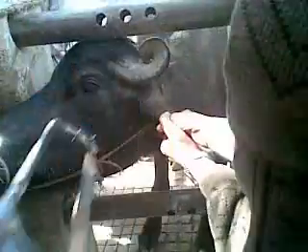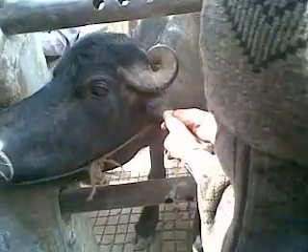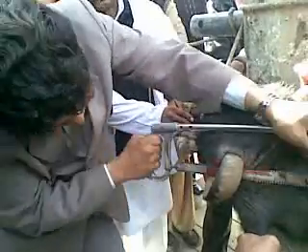I am in the soft tissue, therefore the animal is irritated. Now I am in the bleeding area, so we have cut. Give me the cotton.